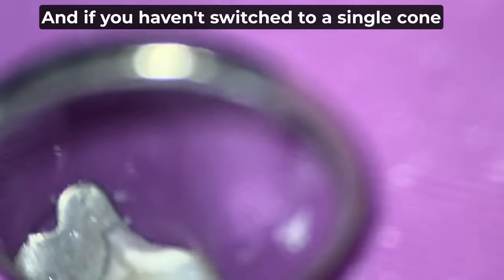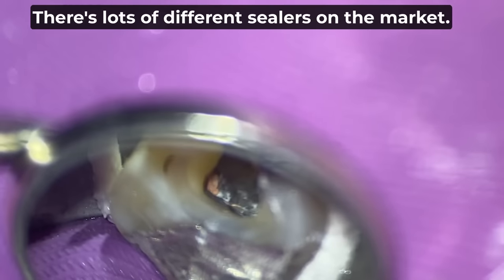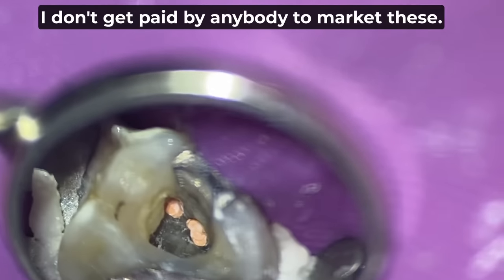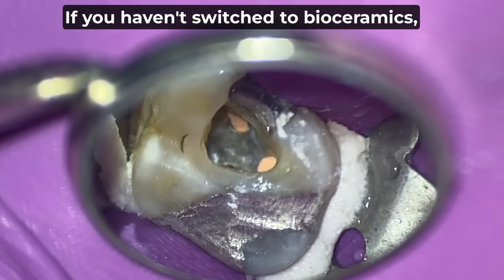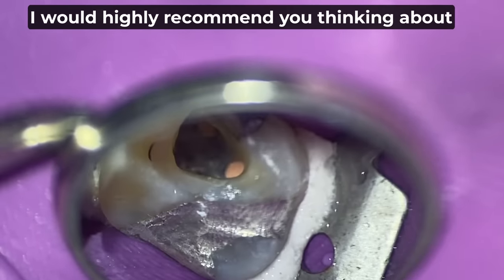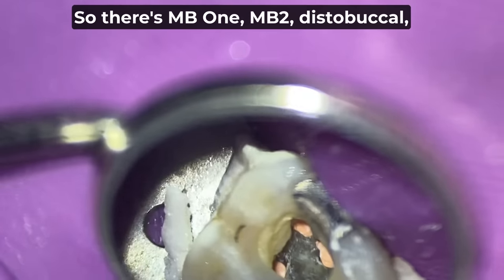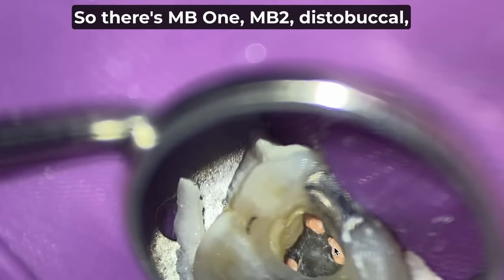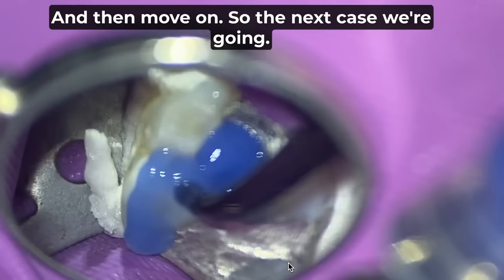And if you haven't switched to a single cone technique, I don't get paid by anybody. There's lots of different sealers on the market. I don't get paid by anybody to market these. If you haven't switched to it, I would highly recommend thinking about it and then trying it on extracted teeth. So there's our case there. There's MB1, MB2, distobuccal, and then the palate, and we're going to etch and then move on.